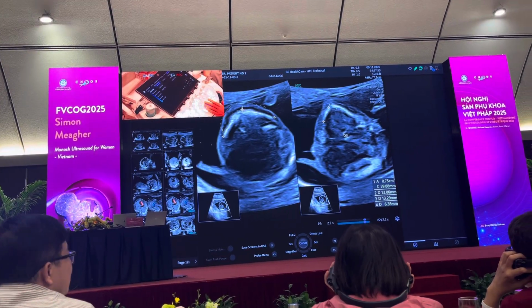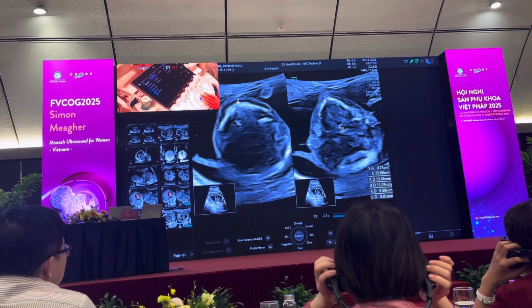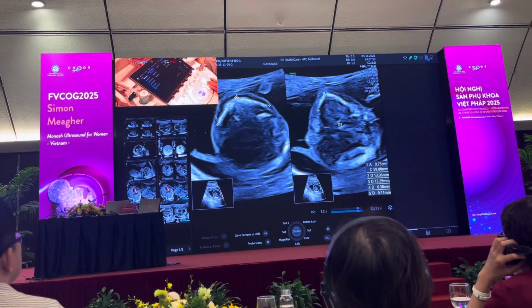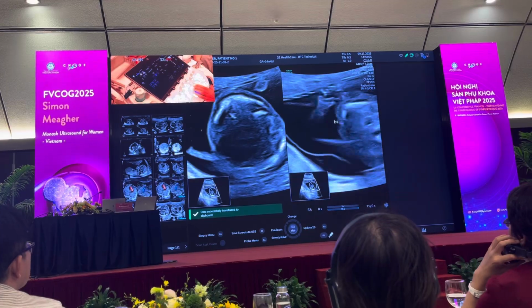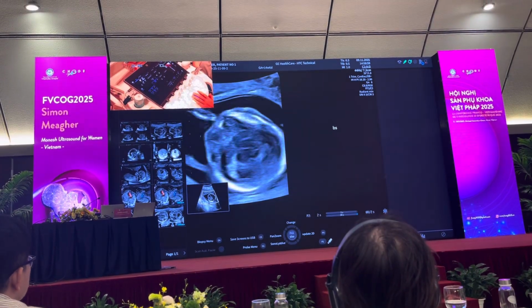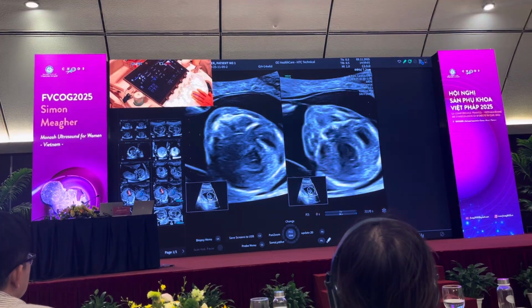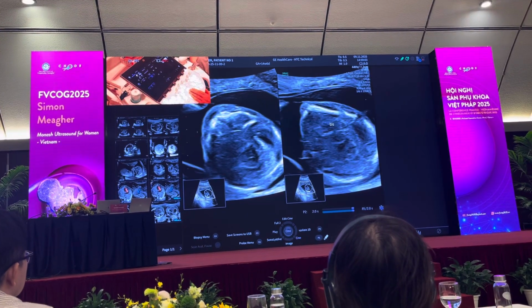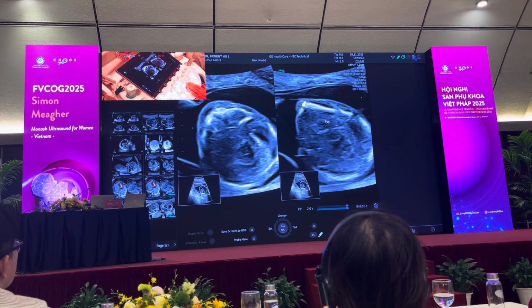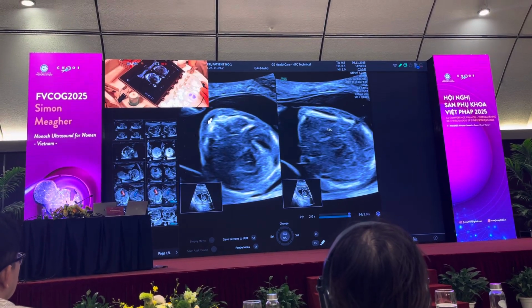And there it's almost like at 90 degrees. And that's how you know whether you're scanning the mandible or whether you're scanning the maxilla. So in a single sweep on that image of a split image, I come down and I see that the maxilla is fine and the mandible has got the gap. The gap tells me that there is no retrognathia and no micrognathia. This tells me there's no cleft lip.